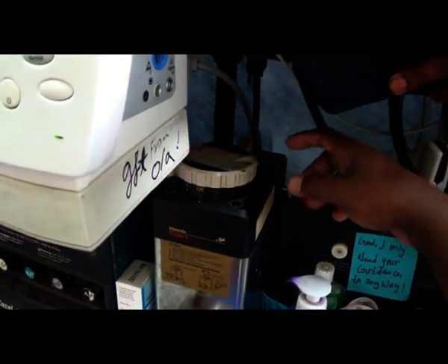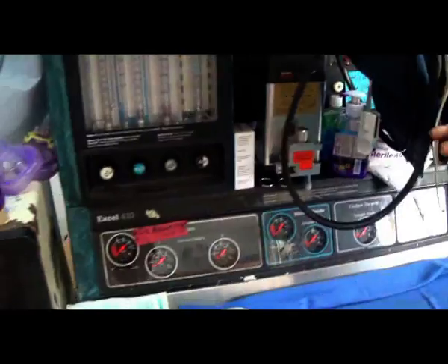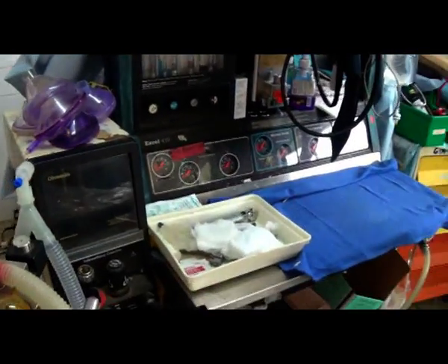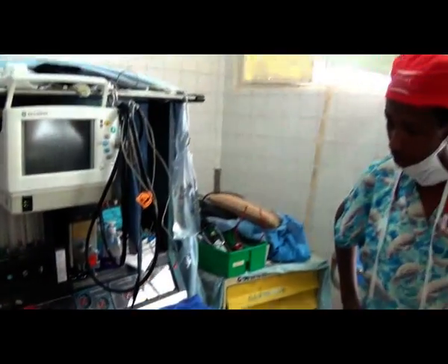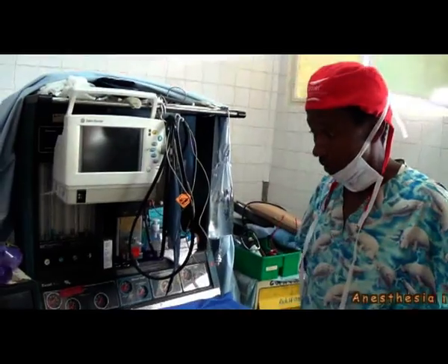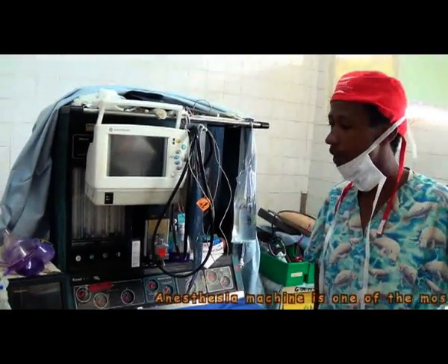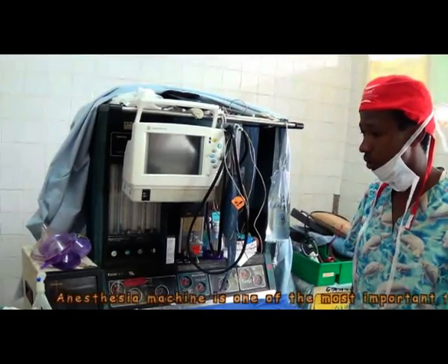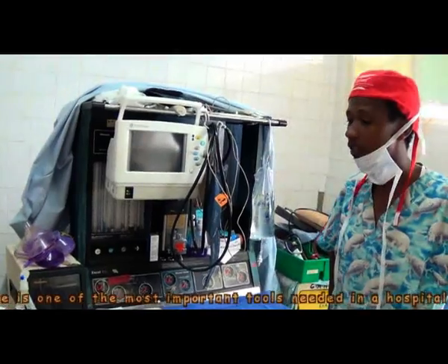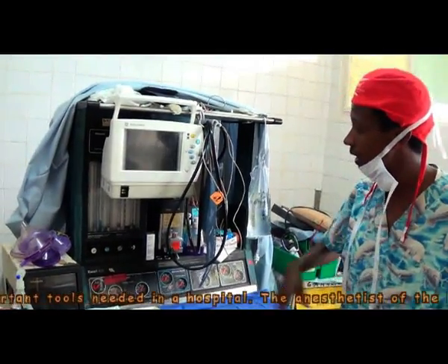Got it. And there are a lot of things that I could not mention at this level because I'm not so familiar with the machines. I know how to handle it rather than how to repair it. I just could not detect its own leak. Even if I give some part of oxygen, not the percent I gave for the patient will reach the patient because it has its own leak. Not only the oxygen, it also has a leak.